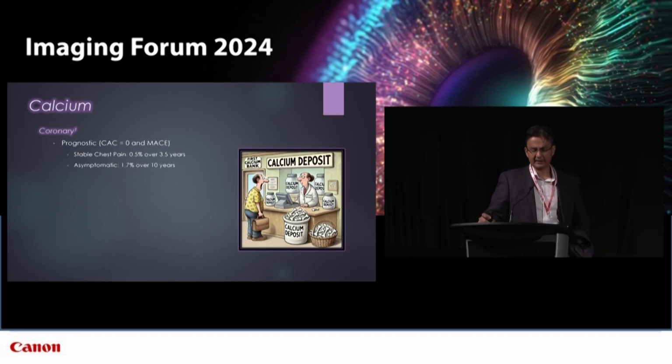Starting with coronary calcium. Coronary calcium is, as some know, a very, very powerful biomarker. Now, if you go to the Society of Cardiovascular CT, there's sort of two camps. There are the folks who think calcium is really, really important, that we need to use it for prognosis, that it's a very valuable tool. Then there's the angiography folks who say, oh, it doesn't really matter. We just want to know if there's obstructive disease. We've had hints of that as we were discussing earlier today.